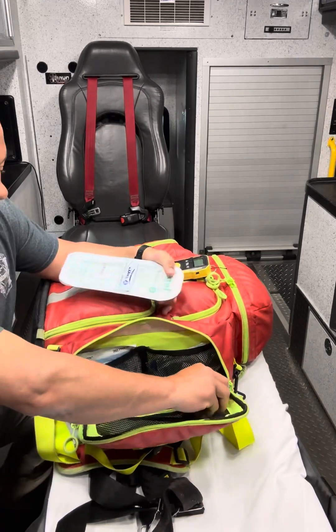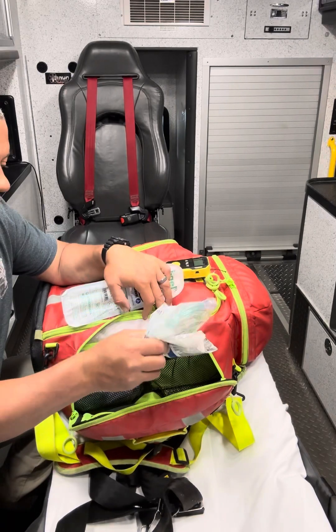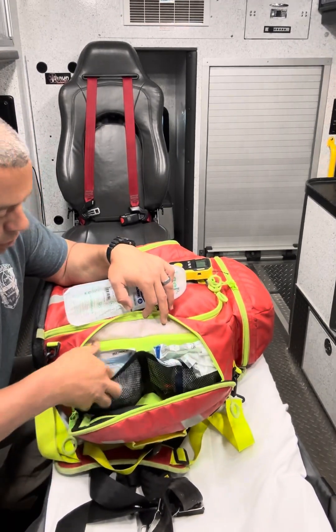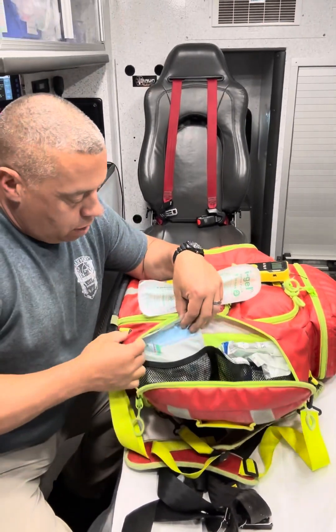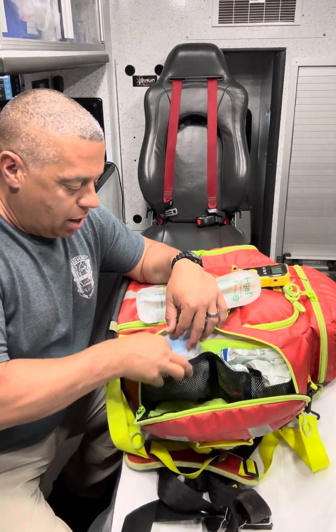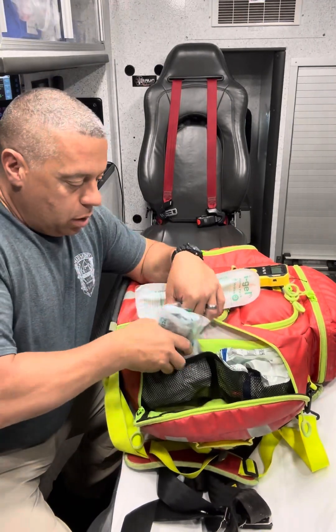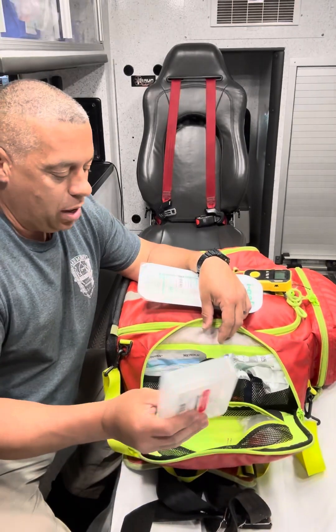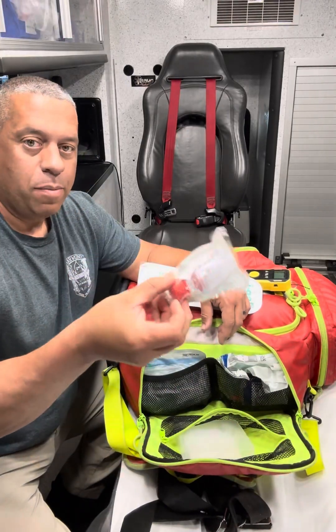This is a size three. Here we have both nasal cannula and inline end-tidal monitoring. And here we have our colorimetric, which is useful for when our crews are just doing BLS — they don't use the colorimetric on the cardiac monitor. And here we have NPAs with lube. Down here will be a set of OPAs, and we have adjustable PEEP that we can put on the end of our BVM.